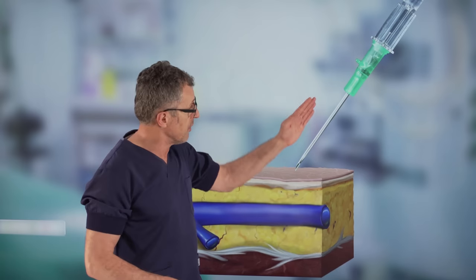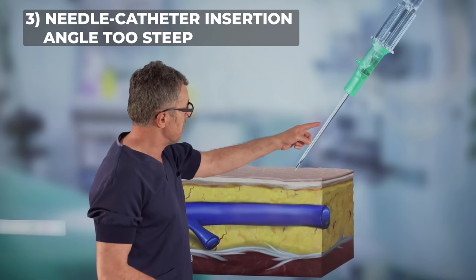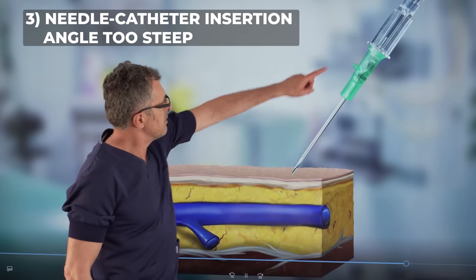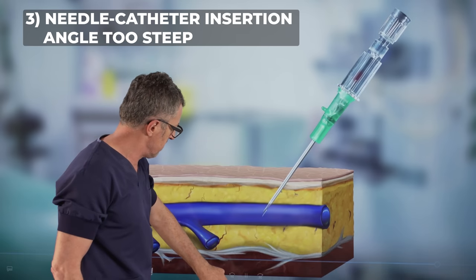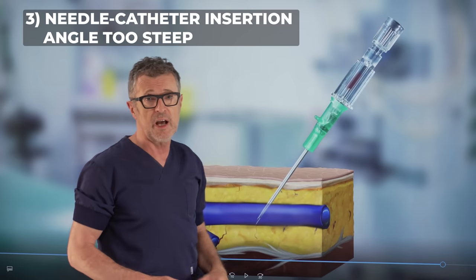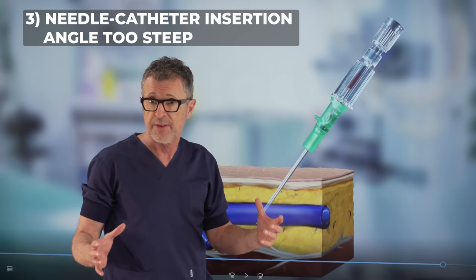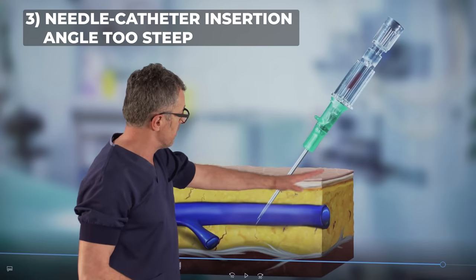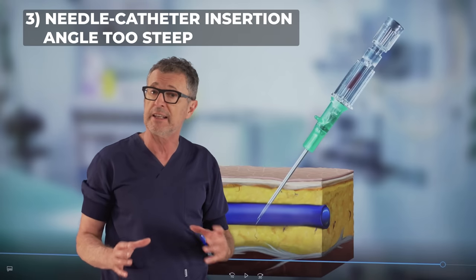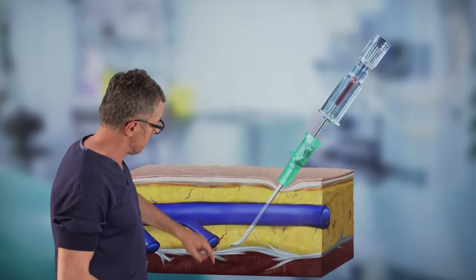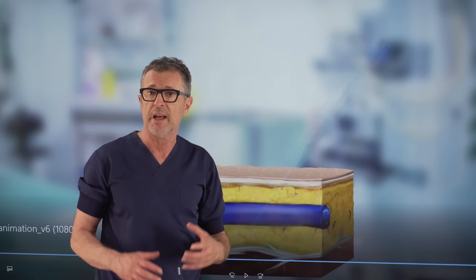Let's see the problem. Failure to advance the needle at a low angle often results in a needle passage through the vein completely. And again, catheter placement paravenously into the subcutaneous tissue. So that's the needle catheter system. It passes through the skin. Now it is in the vein. And as soon as it is in the vein, we can see the flashback. So the operator thinks, okay, we're there. And now what we need to do is we need to advance the needle catheter system a little bit deeper so it is inside the vein. Unfortunately, this high angle will prevent the operator from advancing it at the angle at which the catheter and the needle will stay inside the vein. The needle catheter passes through the vein and then attempted to feed the catheter clearly will result in a catheter placement paravenously. And these are the three most common reasons why IV catheters fail.